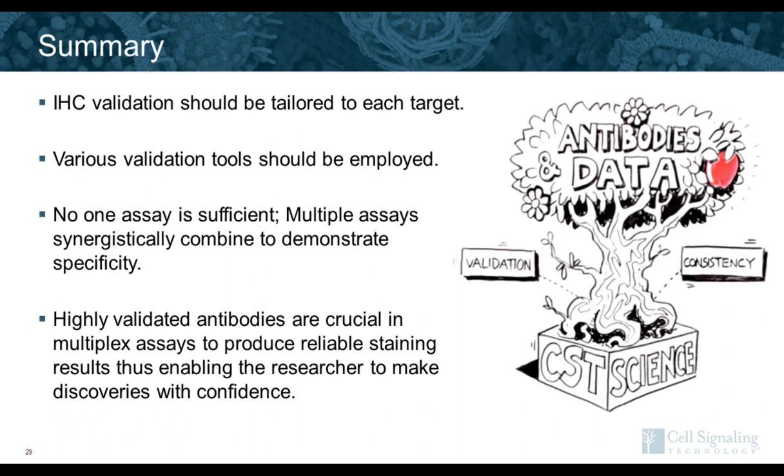When troubleshooting with OPAL reagents, would you recommend diluting OPAL AB colors if you are getting a lot of background? That's a good question. There's a couple of levers you can change when optimizing an OPAL stain. The first is your primary antibody. If you're getting background, then it's probably your primary antibody that needs to be diluted out further. If you're seeing your signal intensity is too high, then you would dilute your OPAL dyes.